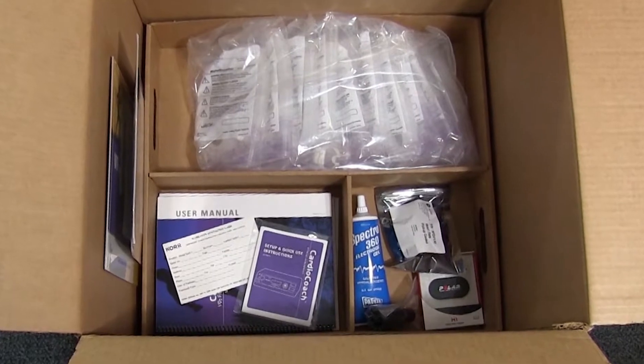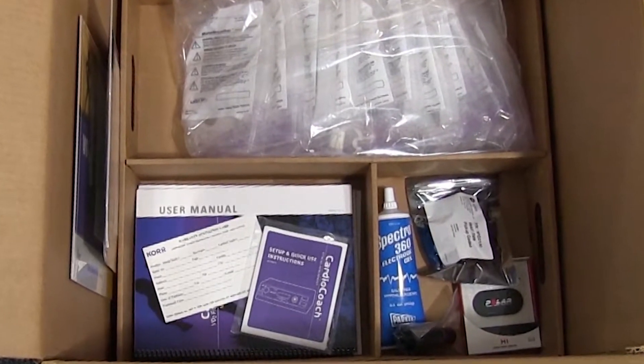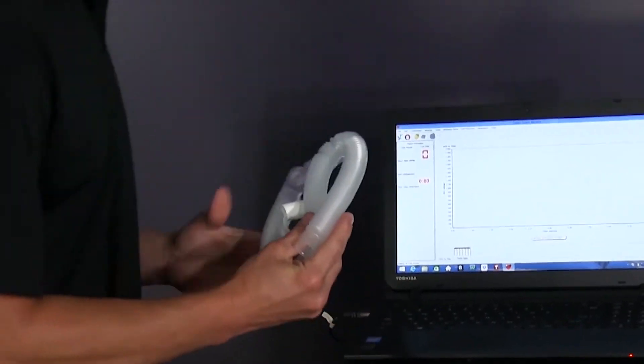Here are some important items to take note of on arrival of your CardioCoach. Core strongly recommends the use of a Core-manufactured MetaBreather to ensure measurement accuracy of a resting metabolic rate test. Core cannot guarantee the ability of this product to accurately measure resting metabolic rates when a breathing device other than a MetaBreather is used.